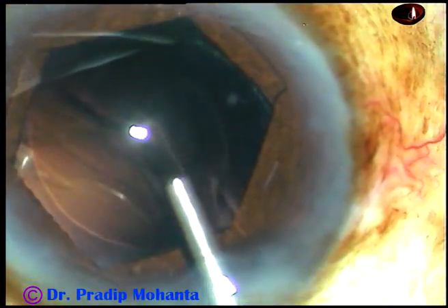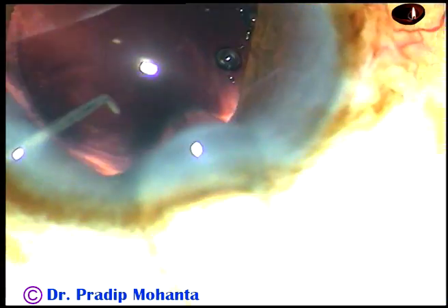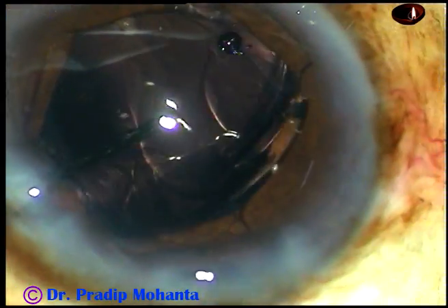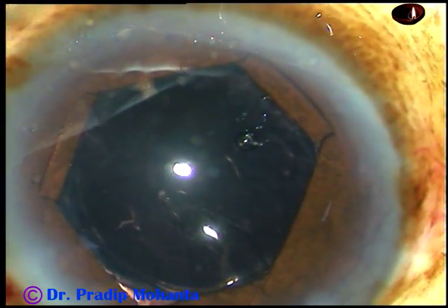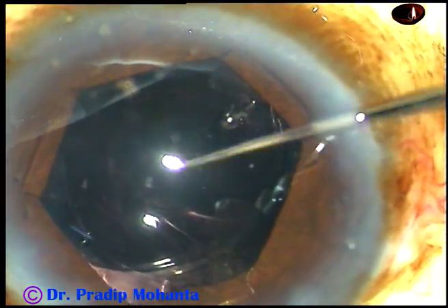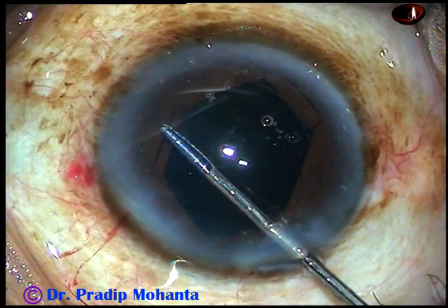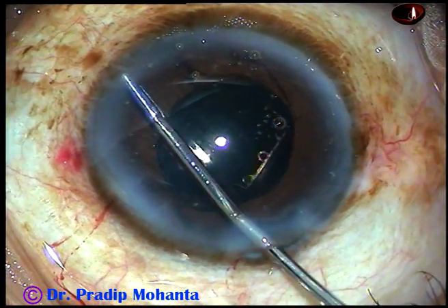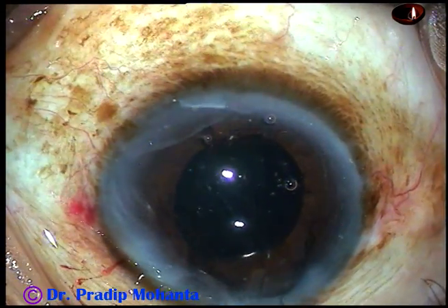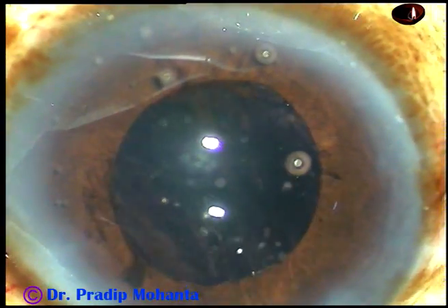And now this is 2% HPMC. And now I am going to implant a foldable intraocular lens in the capsular bag. These patients with hyper-mature cataracts are actually poor. This is how the B-hex device is being explanted and removed.